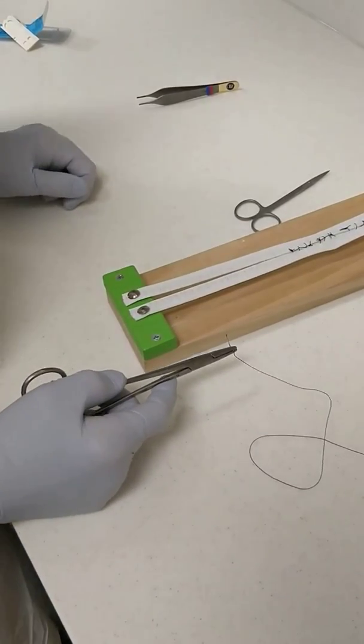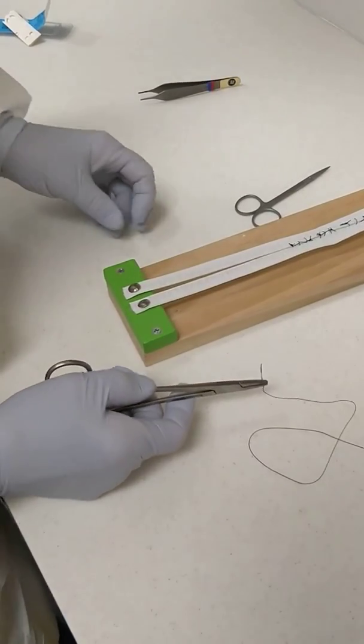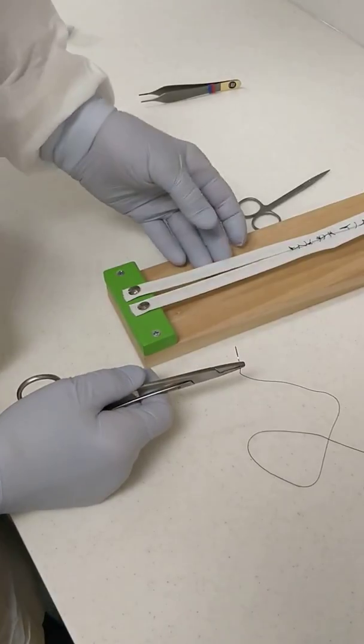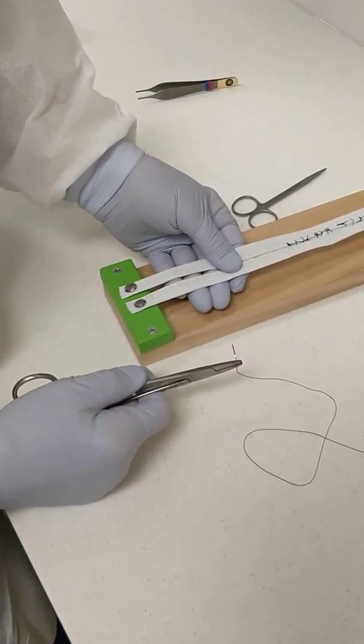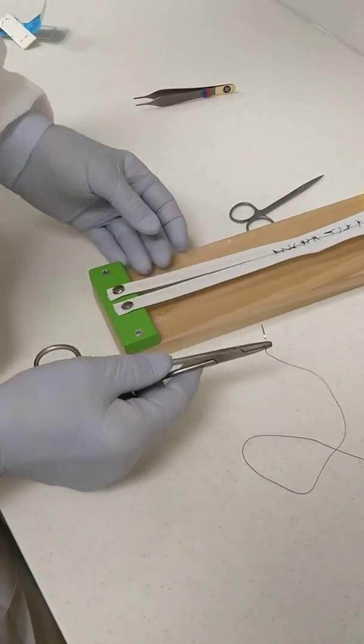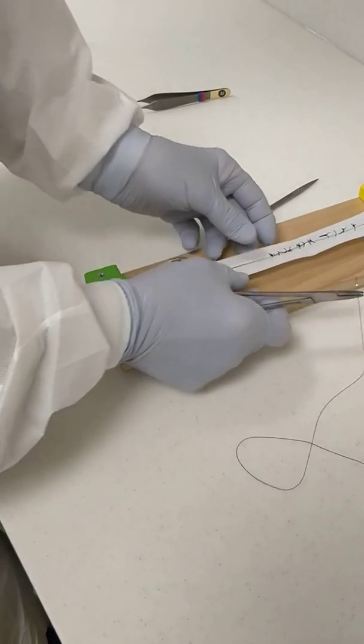There are some additional sutures that you use from time to time. There's a vertical mattress suture, a horizontal mattress suture, and a figure of eight suture. And I'll run through those quickly.